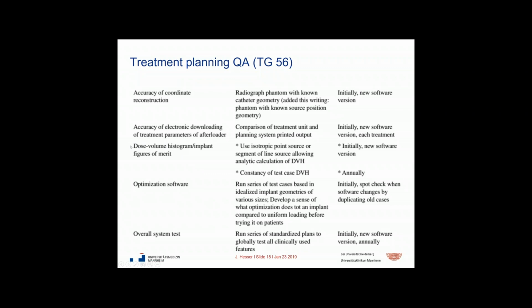Here again, dose volume histogram, that's the pure visualization part, only software dependent, optimization software the same. And the overall system test, it's a digital part, so again, also initially, but since it might affect other things, it's also recommended to do that annually.